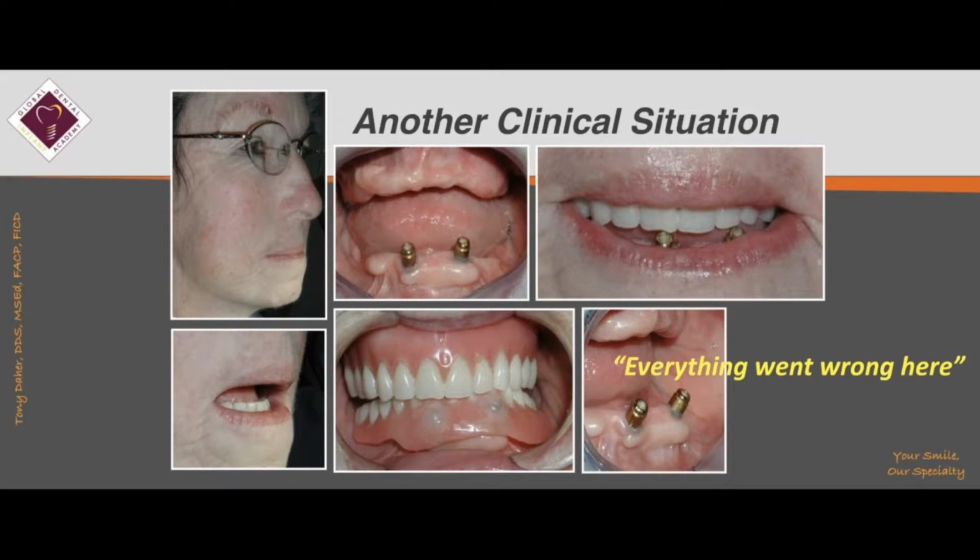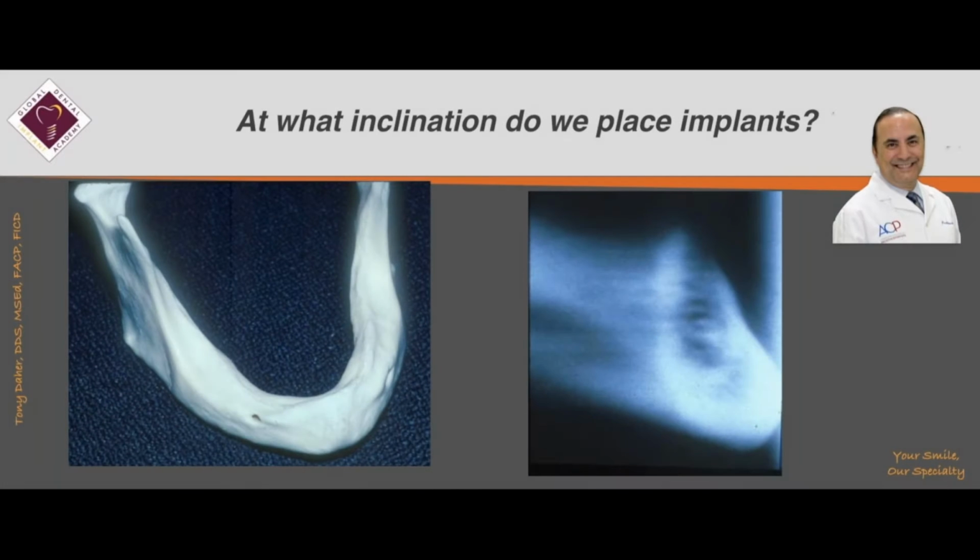Selection of these abutments, locator abutments, very high cuff heights, position of these implants, the shape and the state of the soft tissue on the mandibular arch, the exostosis and all the stuff, the type of occlusion and so on. So a patient had to sue the previous dentist and she got a lot of money.